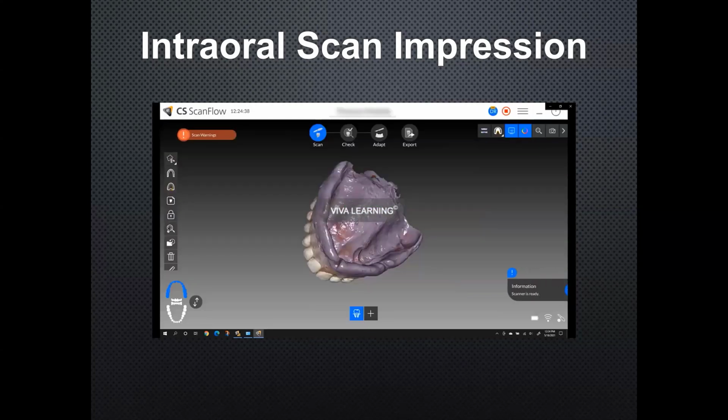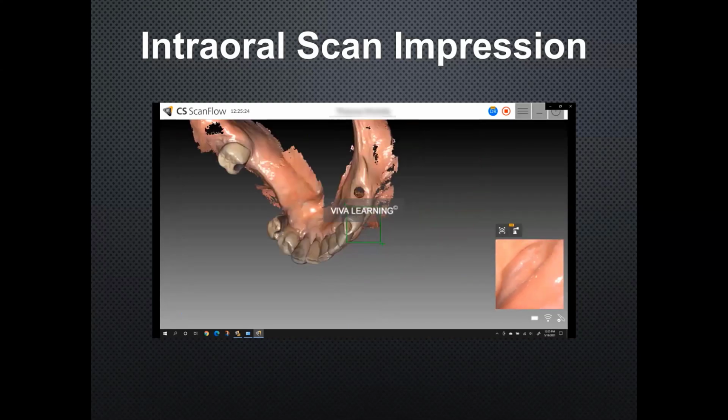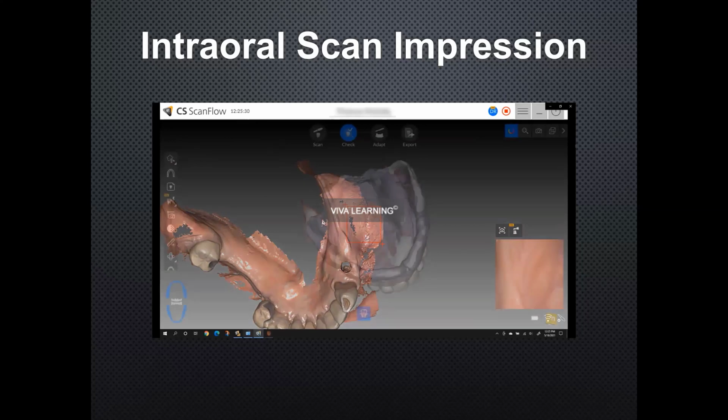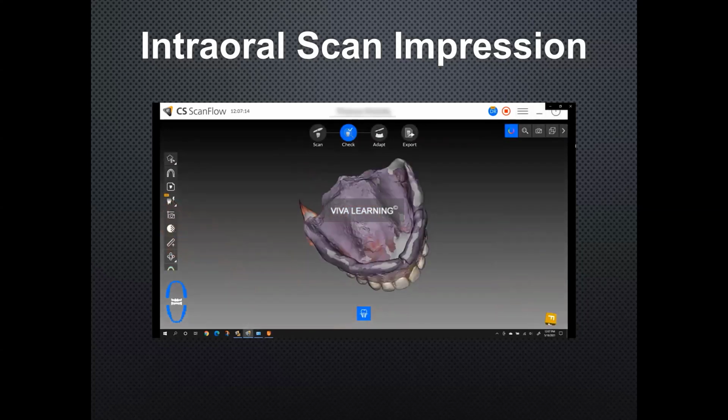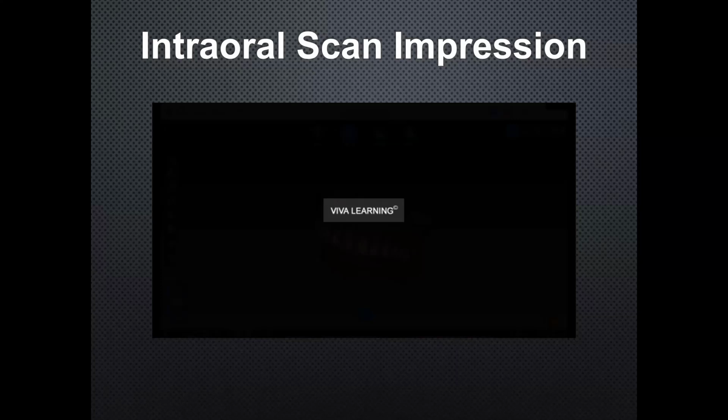And then we take it, then we capture the lower arch, come back and then take the upper denture out and roll over the edges and capture his intaglio surface with the Impregum. On the lower arch, or the arch that you're wanting to work with, especially you want to get nice full border extensions. And we're able to do that and send that to the lab.